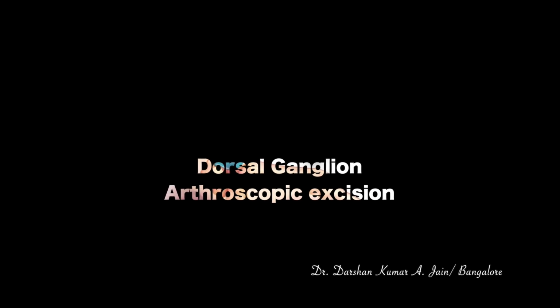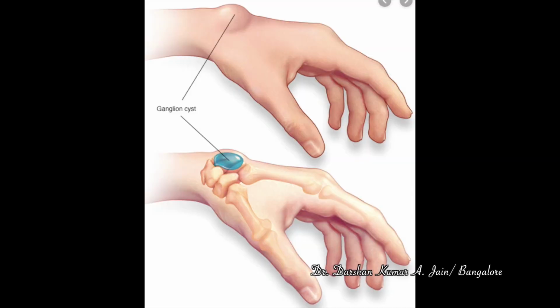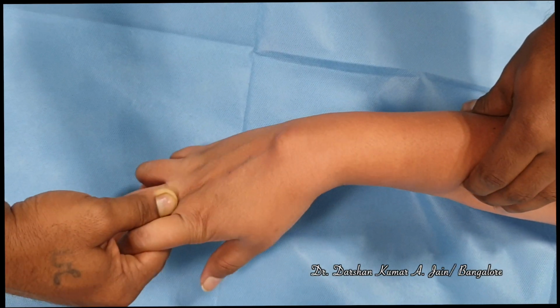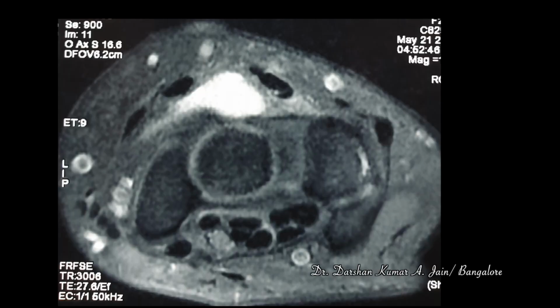This video demonstrates the arthroscopic excision of the dorsal wrist ganglion. Ganglions are fluid-filled sacs arising from the wrist. Dorsal ganglions arise from the radiocarpal joints or from the midcarpal joints. They are usually painless, fluid-filled sacs, and excision is warranted only after a trial of conservative treatment has failed.